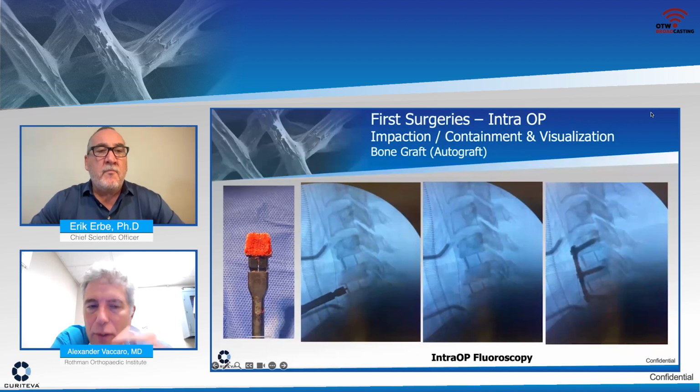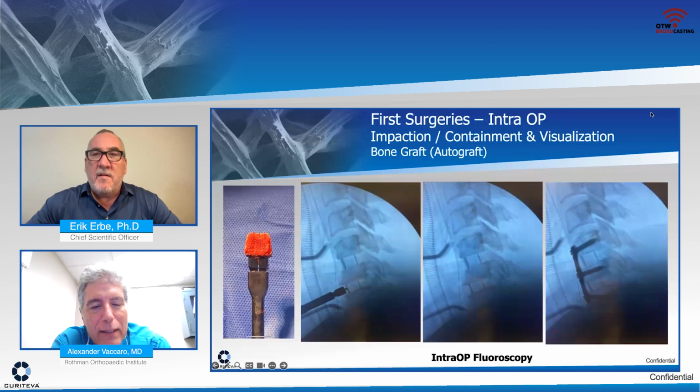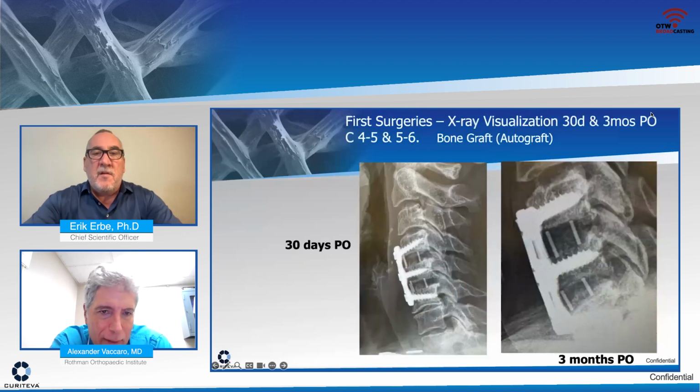And you can envision in the future, if the FDA allows the center portion of the graft itself not to be hollow, and you have a fully 3D lattice in a diamond shape throughout to give it even more end plate support, that you wouldn't need any bone graft filler. But this is perfect. Now I can be comfortable.